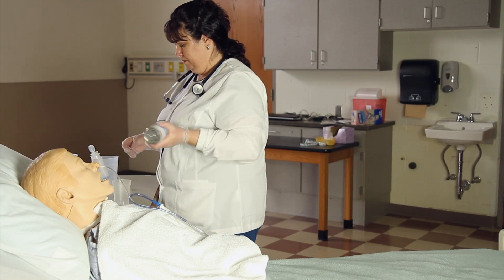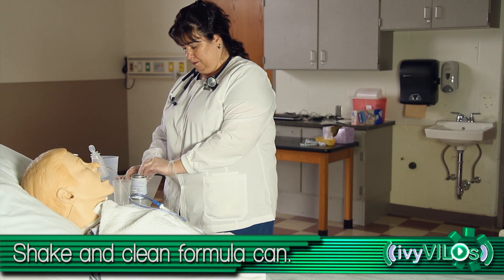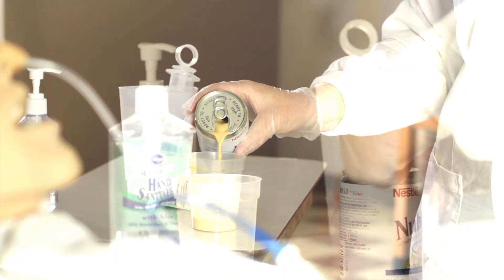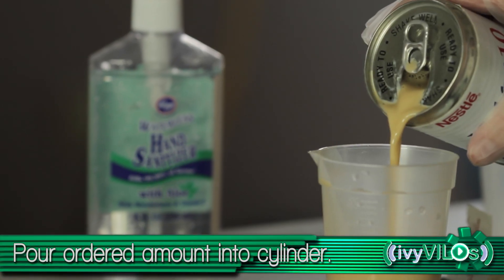Prep the formula by shaking and cleaning the top of the can with an alcohol wipe before opening. Pour the ordered amount of formula into the graduated cylinder or cup.